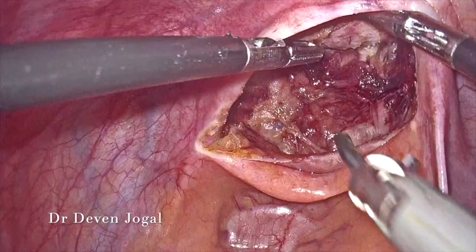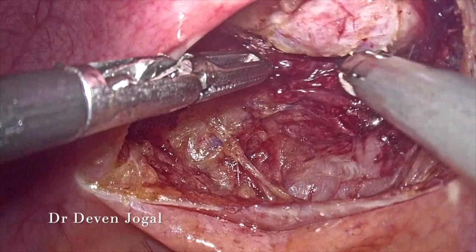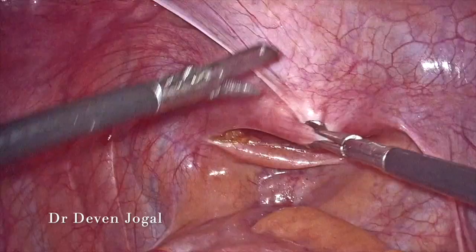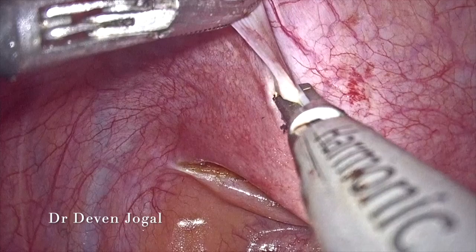Along the vaginal plate, you can appreciate the topmost point of dissection from below. Here is the sponge on a holder pushing from the vaginal end. This is the point where we will be giving the incision later on to connect the lower end of the vagina with the peritoneal cavity.